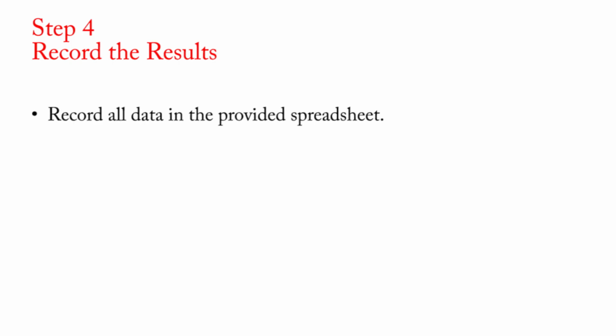Step 4. Record the results. Record all data in the provided spreadsheet. Please reach out to us if you are in need of a copy for your own evaluation purposes. If you are able, please also take pictures throughout the evaluation.